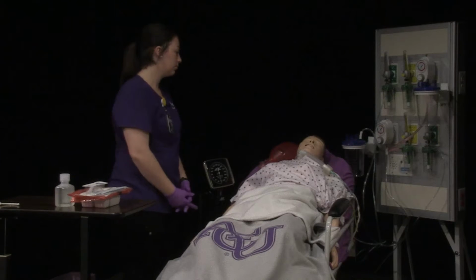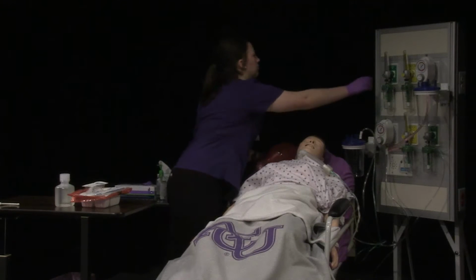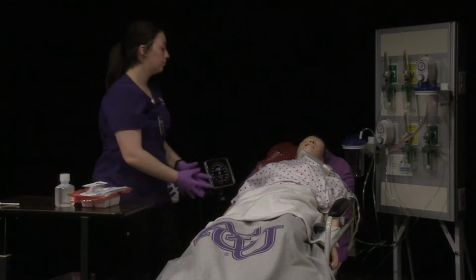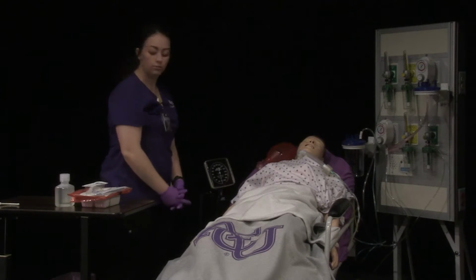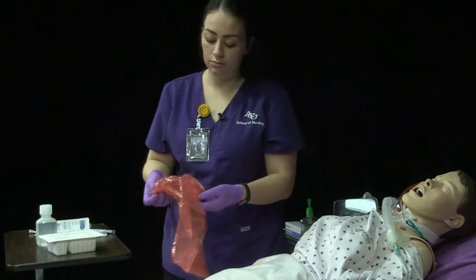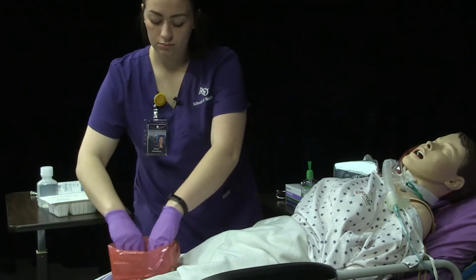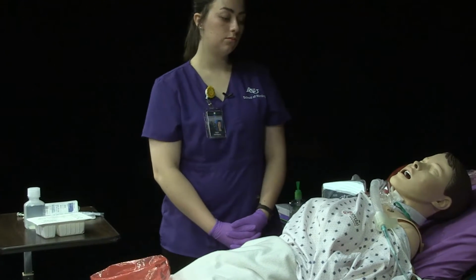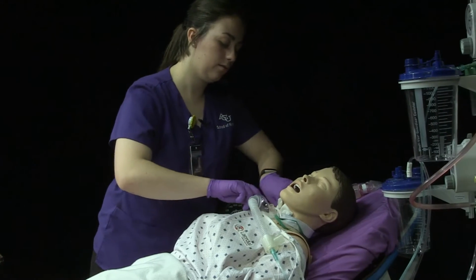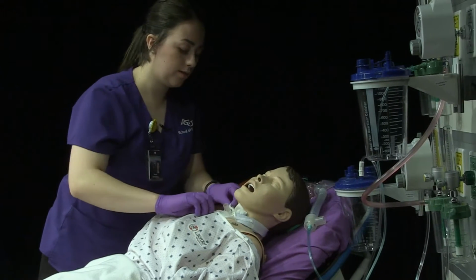Place ambu bag at head of bed and ensure it is operational and has 100% oxygen airflow. Place biohazard bag within reach. Remove tracheostomy dressing and discard per facility policy. I'm going to take your oxygen off so I can get to that dressing. Remove your dressing now.